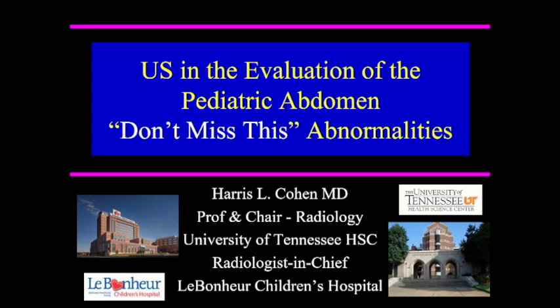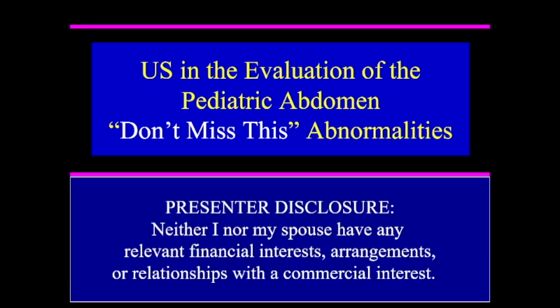So this is a lecture that falls into ultrasound in the evaluation of the pediatric abdomen. Some don't-miss abnormalities.